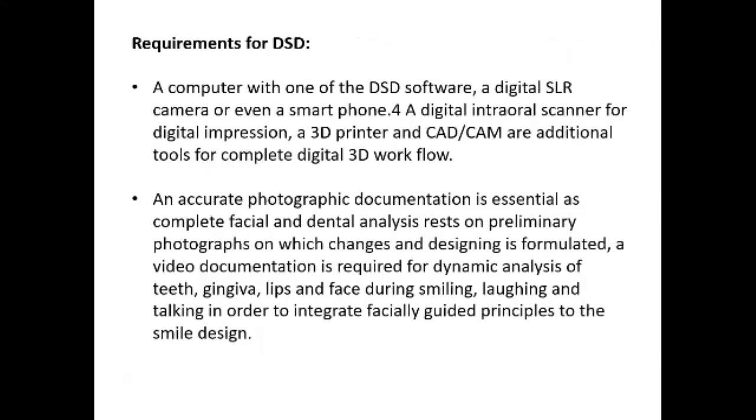So what are the requirements for the DSD? We need a very good computer with the DSD software, a digital SLR camera, or even a smartphone can do, but we can never beat the DSLR. If you want to do it with a smartphone, that's fine, but there are certain limitations. And a digital intraoral scanner for digital impression, a 3-dimensional printer, a CAD/CAM, or additional tools which are required for the complete digital 3D workflow.